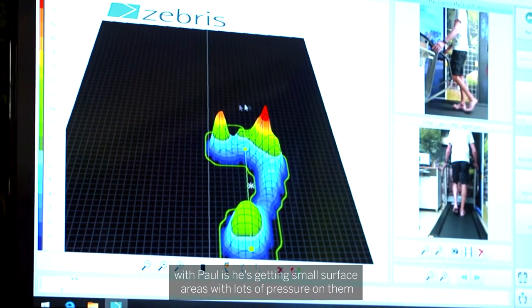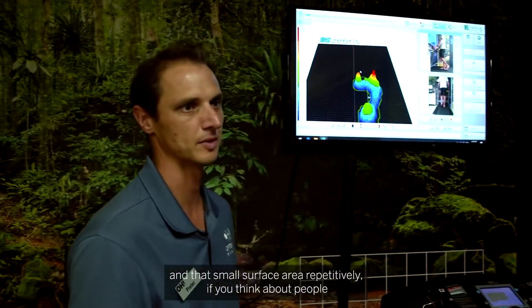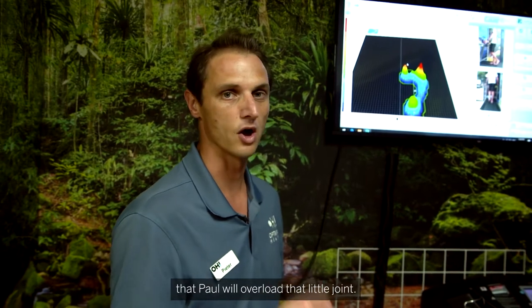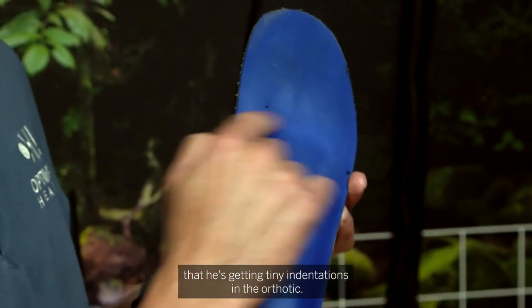What's happening with Paul is he's getting small surface areas with lots of pressure on them. If you think about people taking 10,000 steps at work, it's usually the same spot — that's 10,000 times a day that Paul will overload that little joint. When we look at his orthotics we can actually see tiny indentations forming in the orthotic itself.